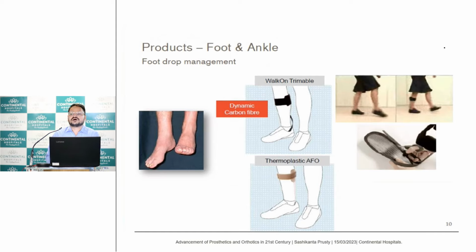There will be certain conditions where, with exercise and therapeutic management, there is a chance of recovery. So on those conditions we don't suggest carbon fiber or AFO, because that takes over the function. Where we find that the chance of recovery is very low, since there has been a foot drop for a long time, then to take over the function and give a proper, good gait pattern, we suggest this kind of brace.